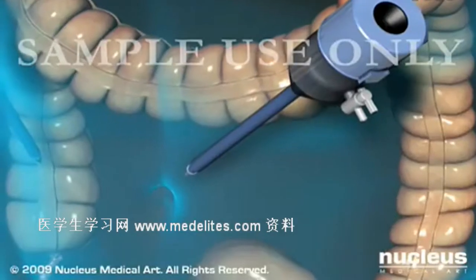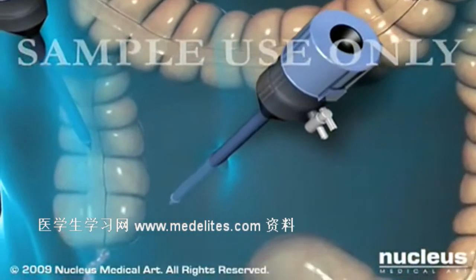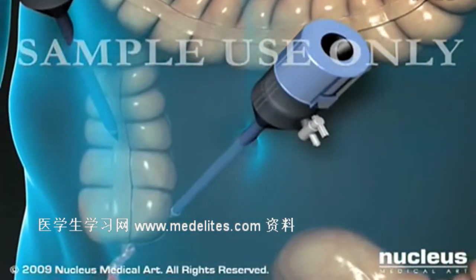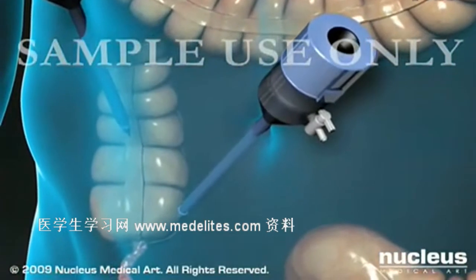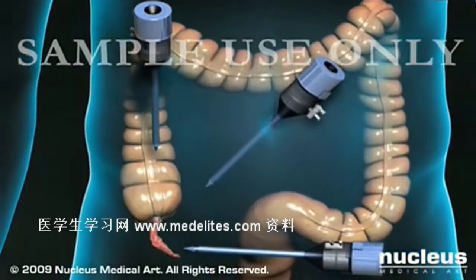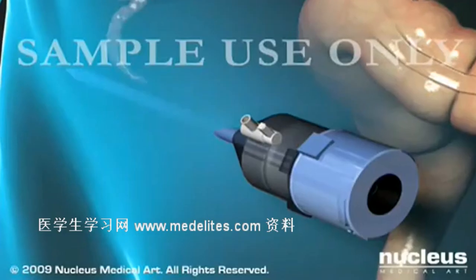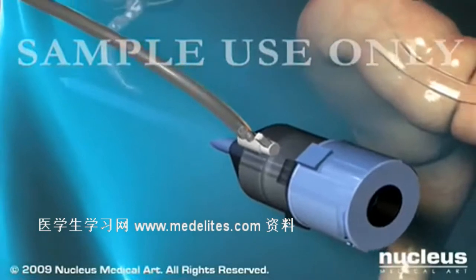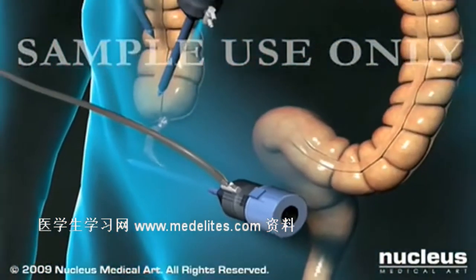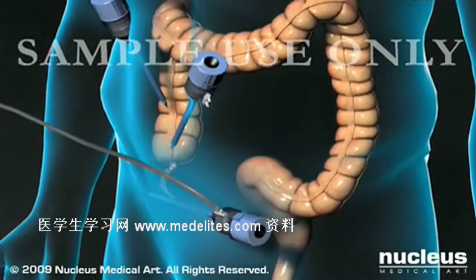To gain access to your appendix, your surgeon will use sharp instruments called trocars to create 3 small holes or ports through your abdominal wall. These ports are usually located at your navel or umbilicus and in the upper right and lower left quadrants of your abdomen. Carbon dioxide gas will then be pumped through the umbilical port to puff up your abdomen so its contents can be viewed more easily.